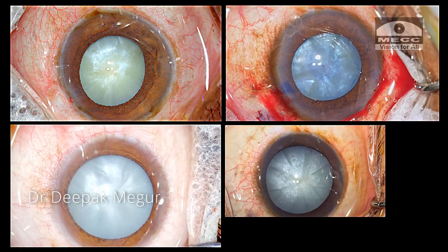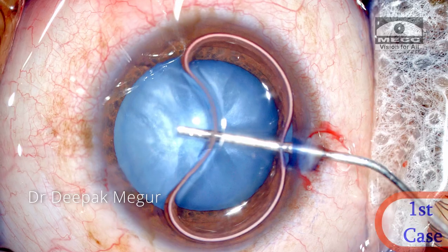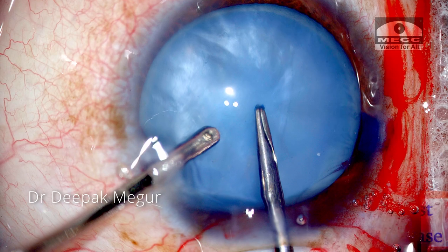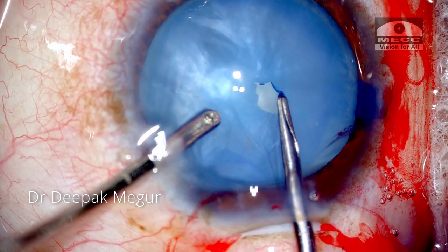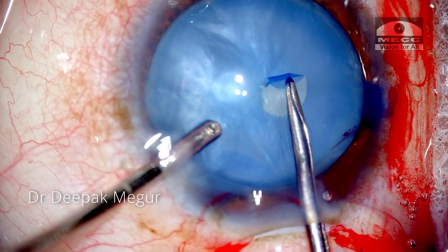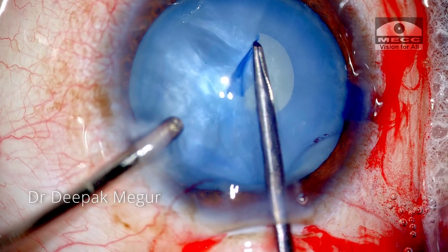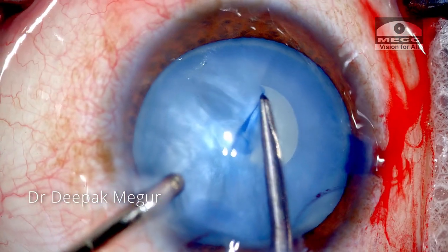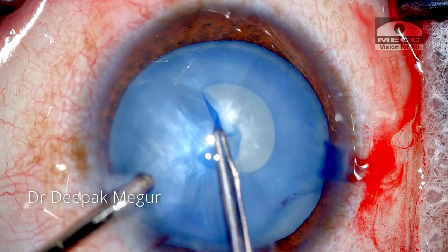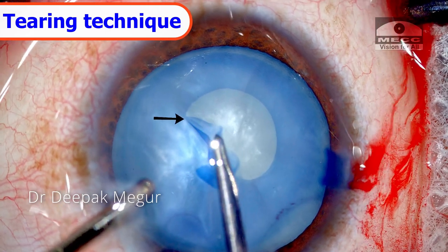All the cases shown in this video will be intumescent lenses. The chamber is filled with dispersive OVD and the globe is stabilized. I'm using the Haldipurka forceps to puncture the capsule, then one flap is caught and I begin tearing. My goal is to create a small rhexis, using a combination of shearing and tearing technique to ensure absolute control. As soon as I get a hint that I'm losing control over the tear, I switch to the tearing method for that section.